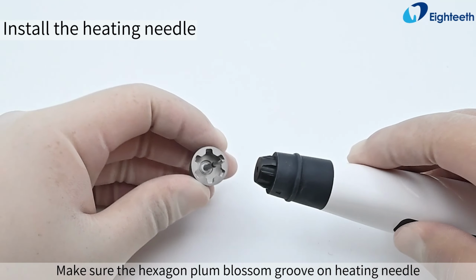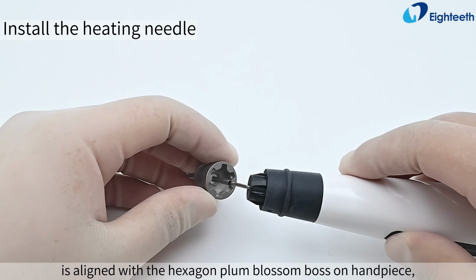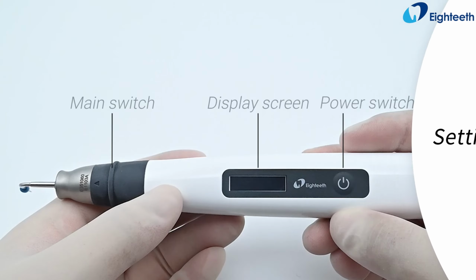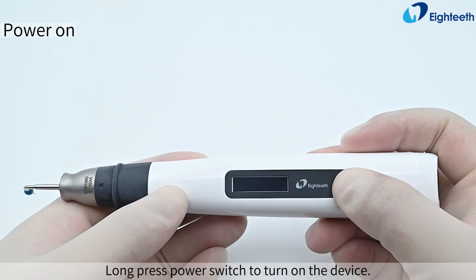Make sure the hexagon plum blossom groove on heating needle is aligned with the hexagon plum blossom boss on handpiece, push tilt to position. Long press power switch to turn on the device.